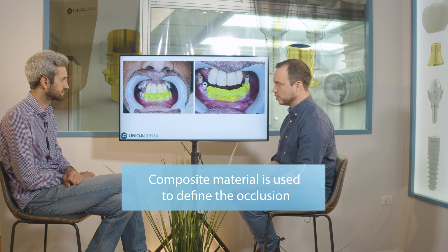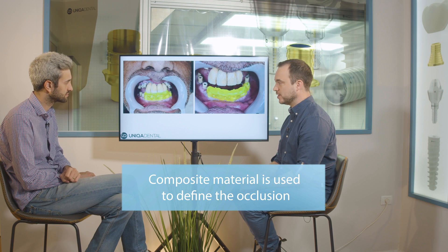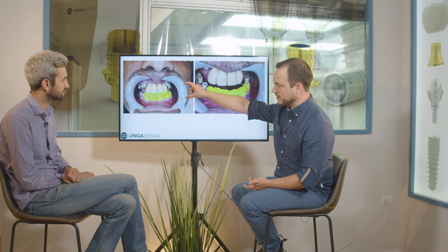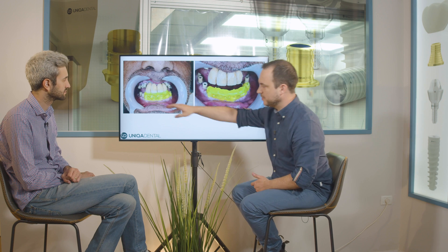We added composite material on the lower scan abutments, defined the vertical dimensions, and scanned this composite material in occlusion. We know this will be the height of the teeth for the lower jaw. For the upper jaw it'll probably be a little smaller, but from the anatomy of the face, this height is good — though the occlusion line may shift slightly higher depending on the smile line and other anatomic factors.